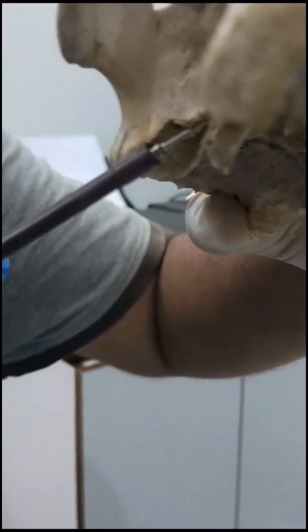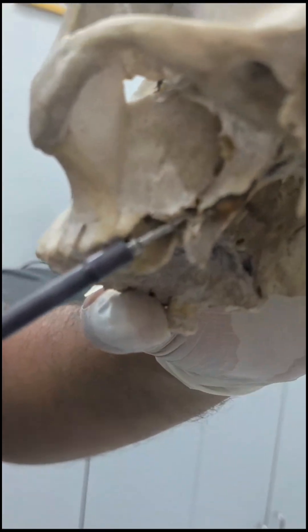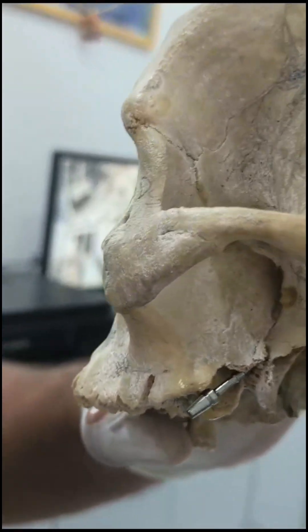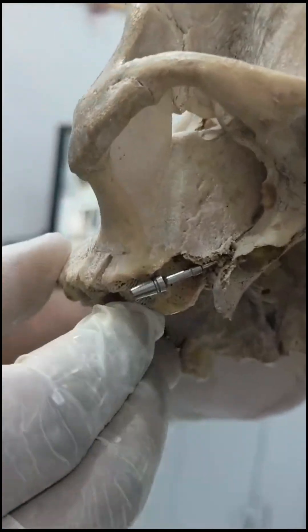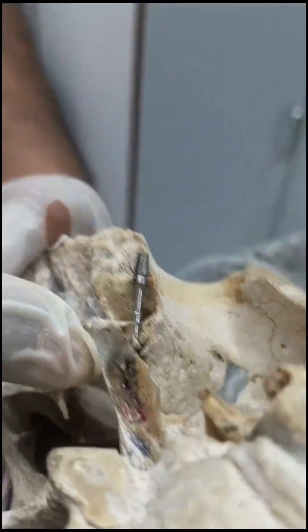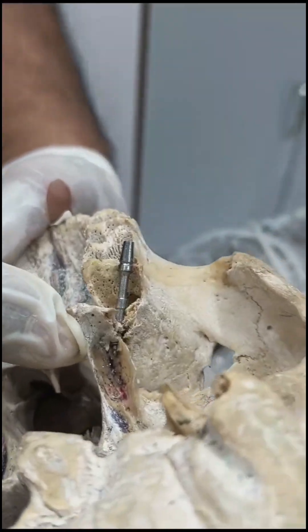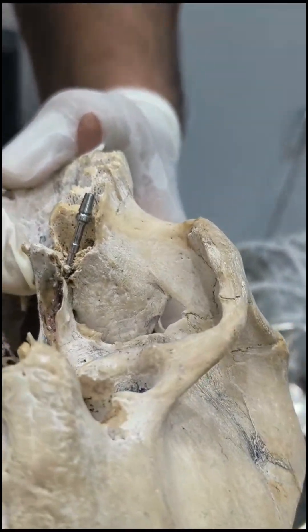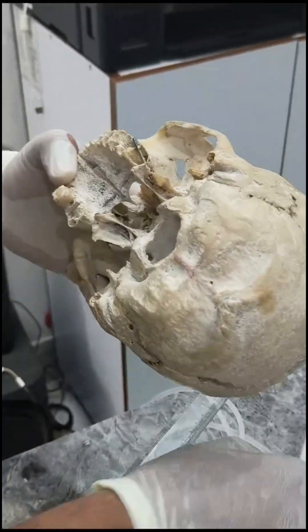The neck portion of the implant has merged with the soft tissue. This is a perfect placement — we are exactly within the pterygoid plate. Using an explorer, you can appreciate the implant strut jutting out right in there.